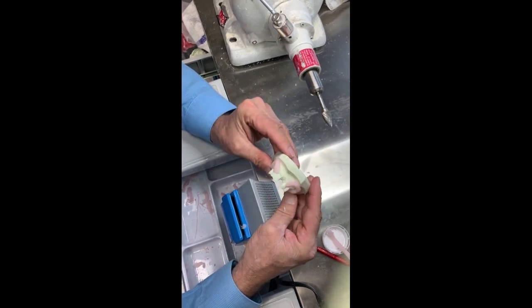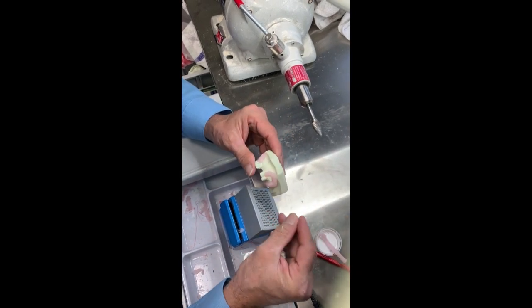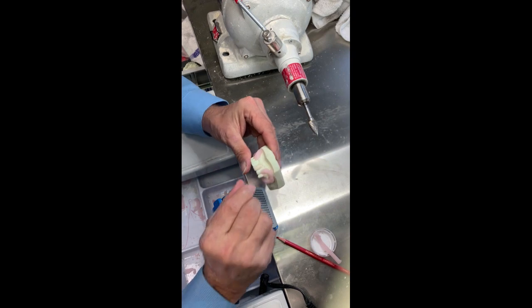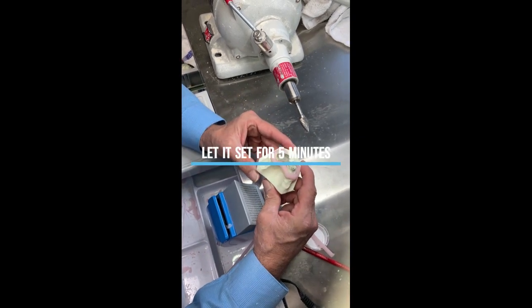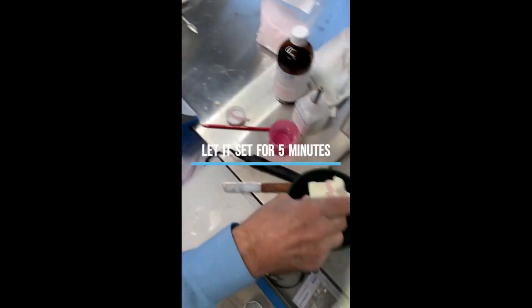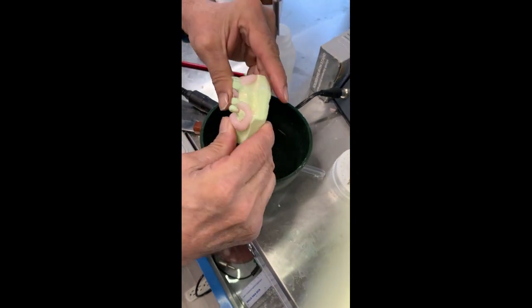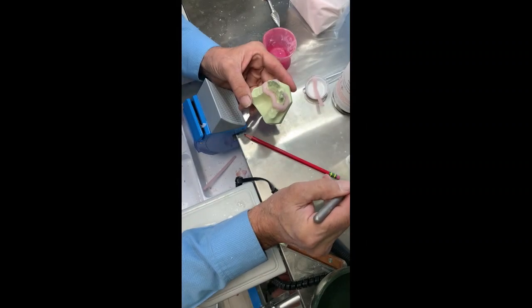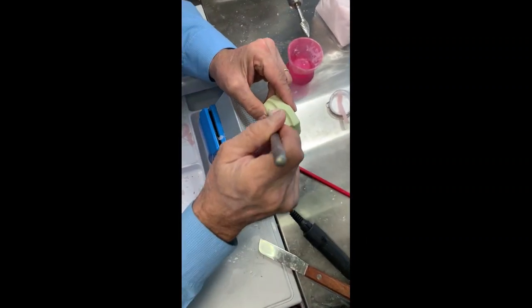Get it ready. I've already carved the tooth in, but you want to carve the tooth in actually before you put the wax. Have it ready to go. Then you want to place this in regular tap water for about 5 minutes. Go ahead and remove from water, and carefully blow it off. Then just paint your separator. Denture separator works fine.